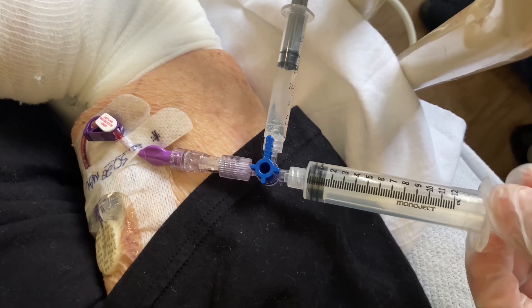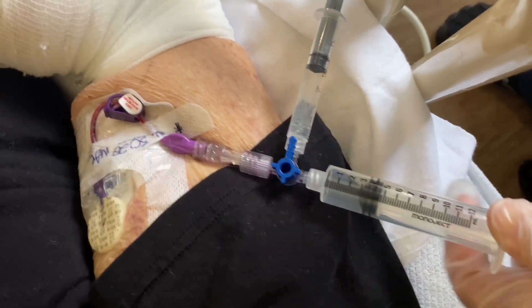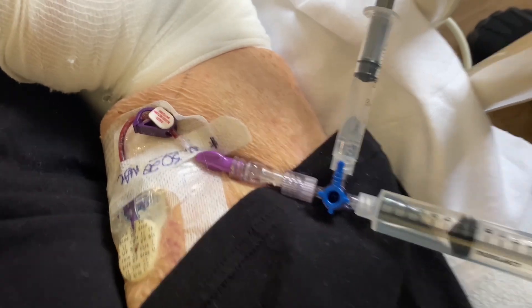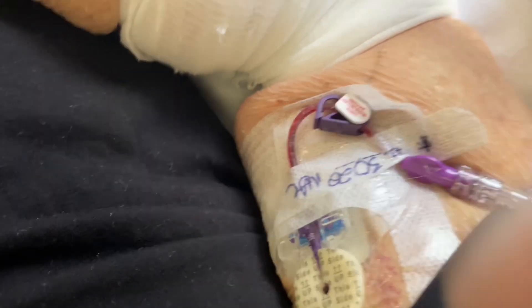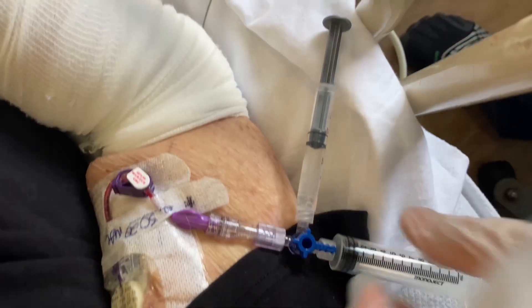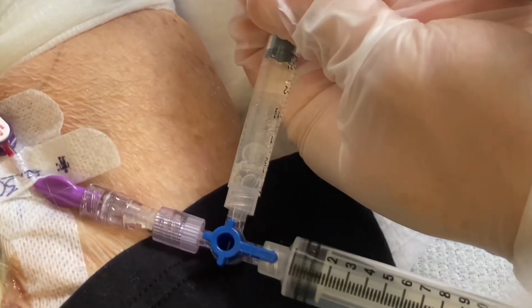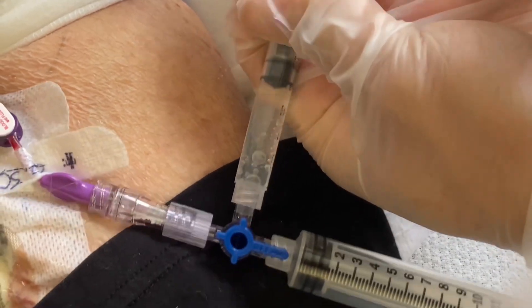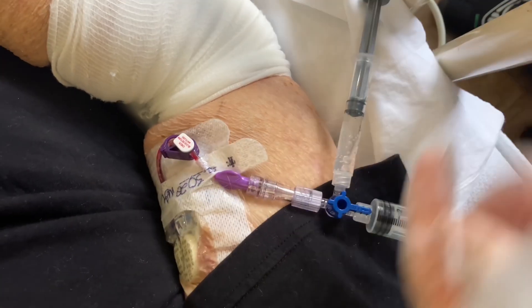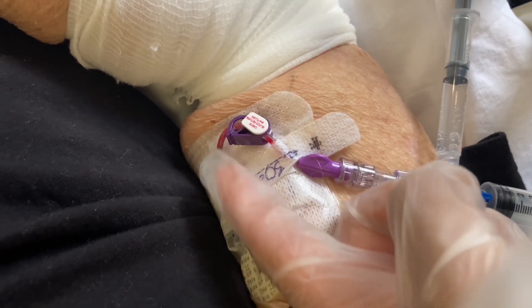Here we have the stopcock applied. I have a syringe. I'm going to apply negative pressure to create a vacuum in that line as much as I can, and then I'm going to turn the stopcock to my site and let that kick in. Then I'm just going to repeat back and forth to agitate the liquid to touch all the clotting little by little.